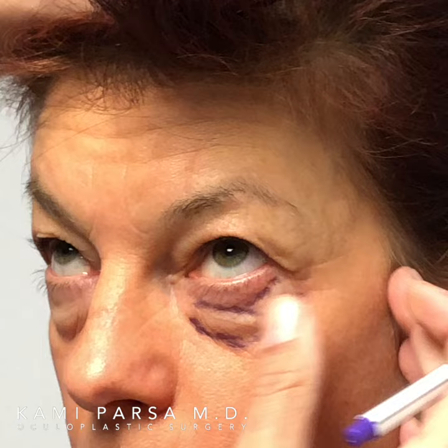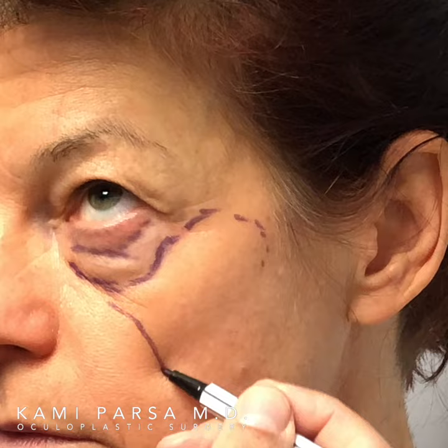I go ahead and mark the area of volume deficit, which is here over the zygoma midface. This is the area that will be filled.